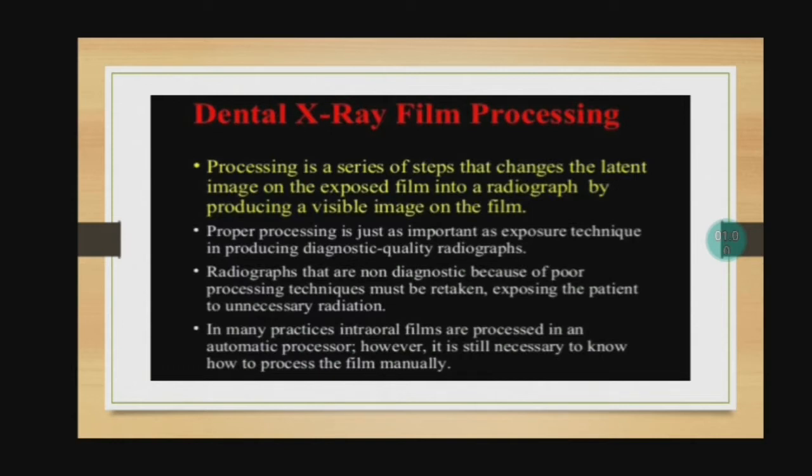Dental X-ray film processing. Processing is a series of steps that changes the latent image on the exposed film into a radiograph by producing a visible image on the film. Proper processing is just as important as exposure technique in producing diagnostic quality radiographs. Radiographs that are non-diagnostic because of poor processing techniques must be retaken, exposing the patient to unnecessary radiation.